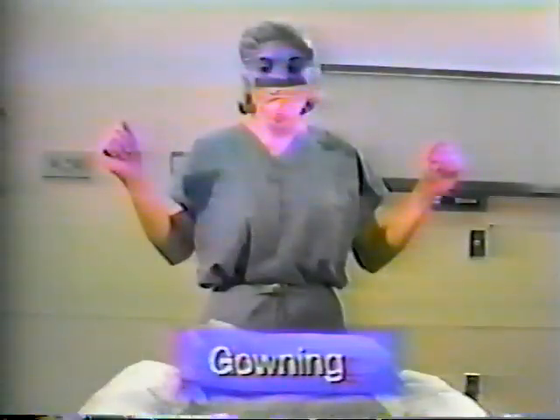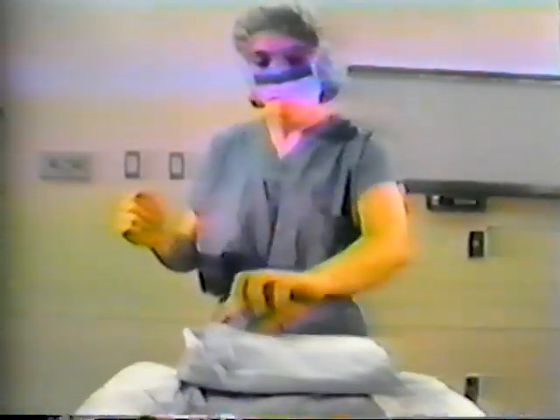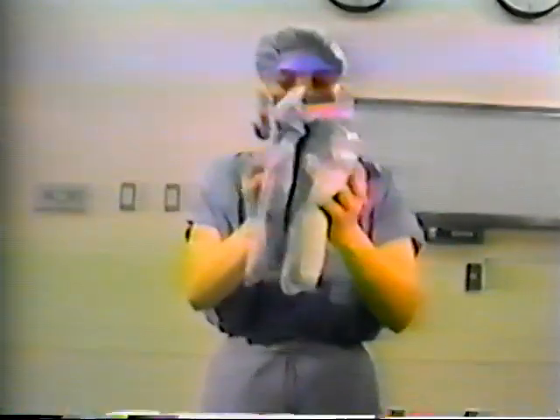To don the gown, lift the folded gown directly upward from the sterile package. Step back from the table. Carefully locate the neckband and hold the inside front of the gown just below the neckband with both hands.